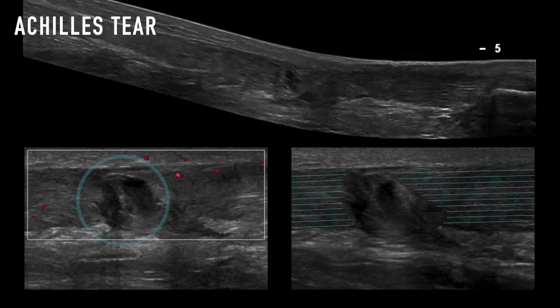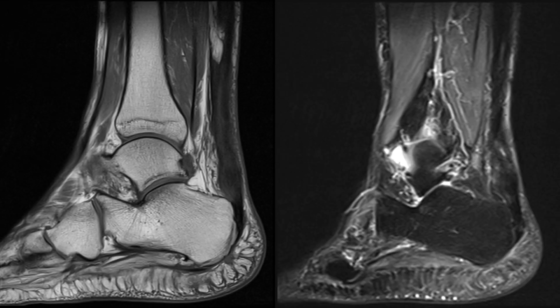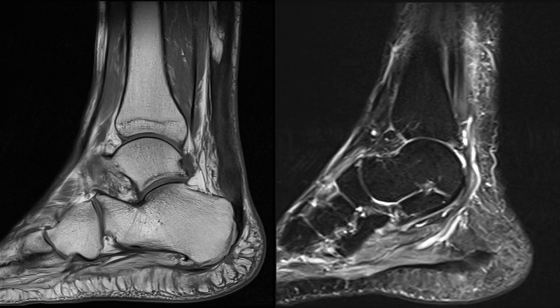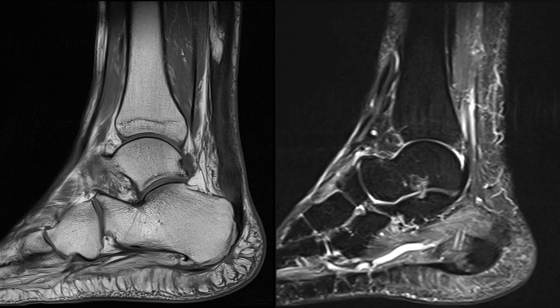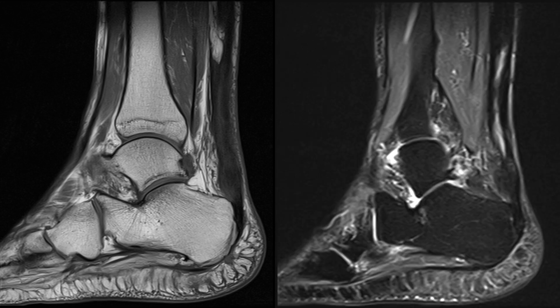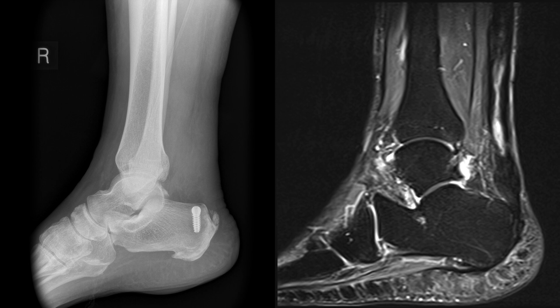This is another example of an Achilles tear on ultrasound. And finally, the same pathology as seen on MRI. Note the high signal within the Achilles tendon indicating a rupture. This patient had surgical repair of the Achilles tendon tear, as seen by the surgical screw on X-ray.